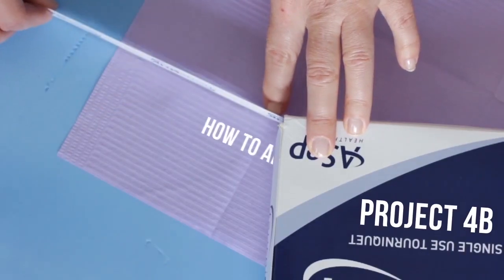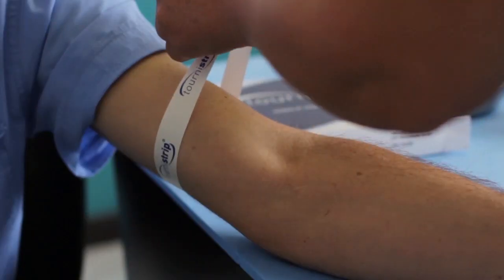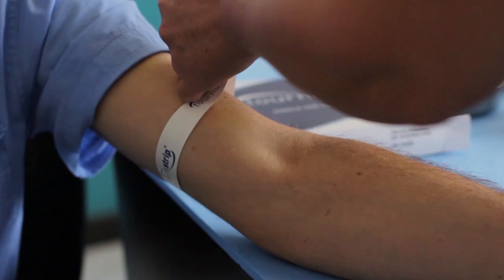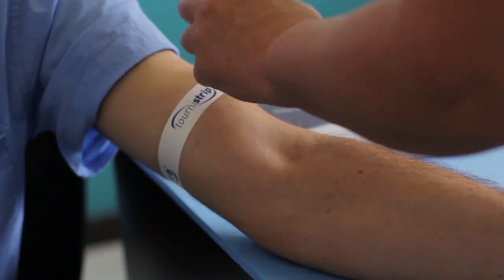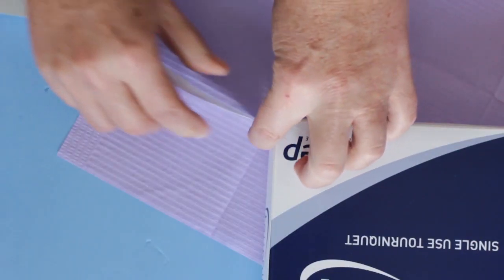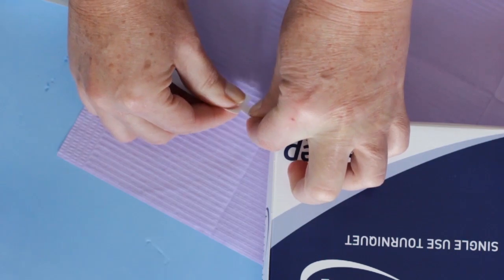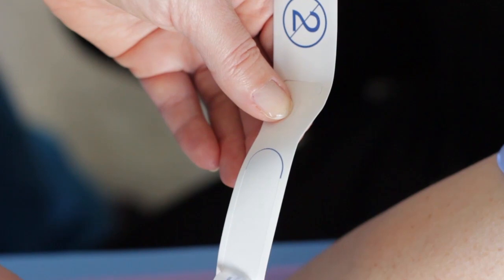Project 4B: How to Apply a Tourniquet Strip. The tourniquet strip is an easy-to-use disposable tourniquet that complies with a single-use tourniquet protocol. Pull a tourniquet strip from the roll of strips in the box and tear along the perforated line. Peel off the removable strip to expose the adhesive panel.